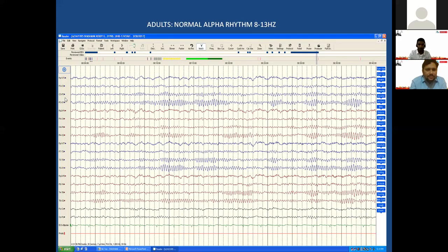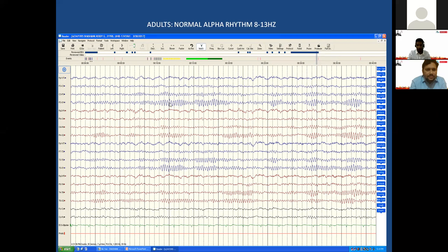This is an example of a normal EEG, showing frontal, central, occipital, and parietal areas. Left-sided leads with odd numbers are in blue, right-sided leads in red. Waveforms are more prominent in the posterior head region — P3O1, P4O2, T5O1, T6O2 — because electrical activity is better represented posteriorly. This frame is one second; counting the crests or troughs gives around 12 Hz, which is in the normal alpha range.